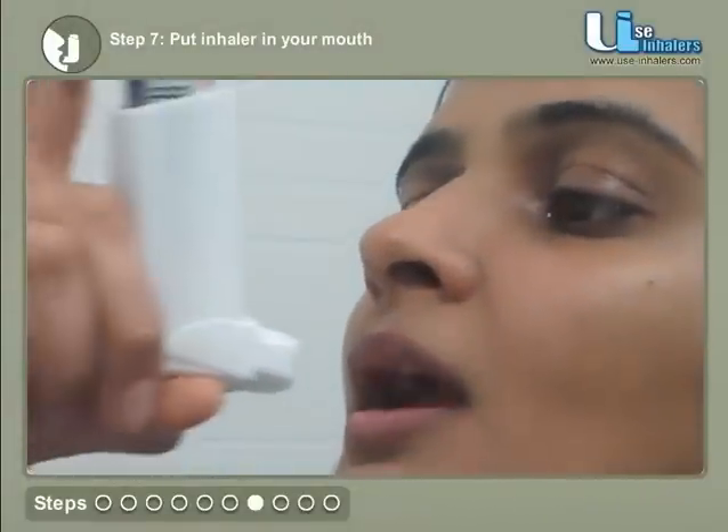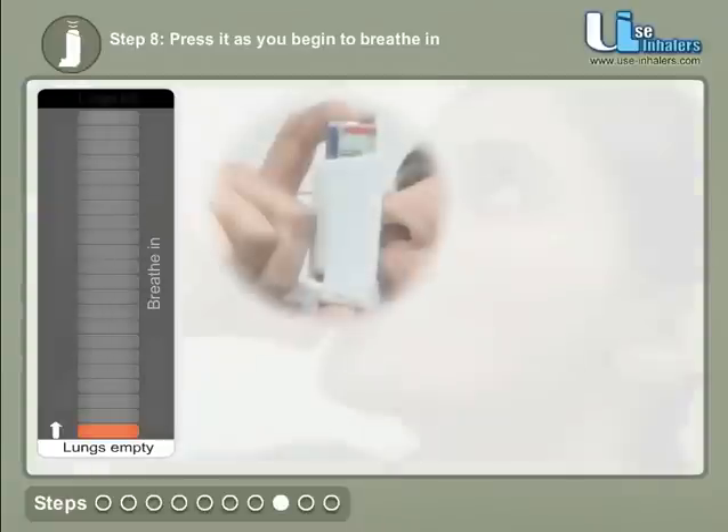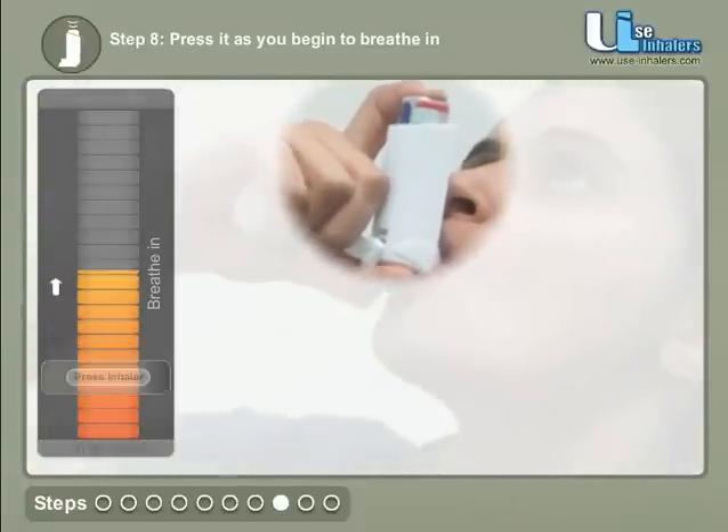Place the inhaler between your teeth and keep the tongue below the mouthpiece. Press the inhaler immediately as you begin to breathe in.